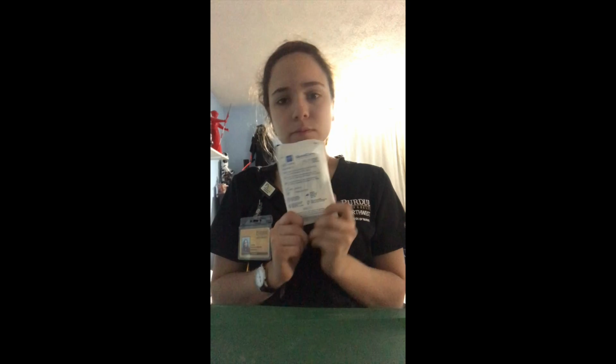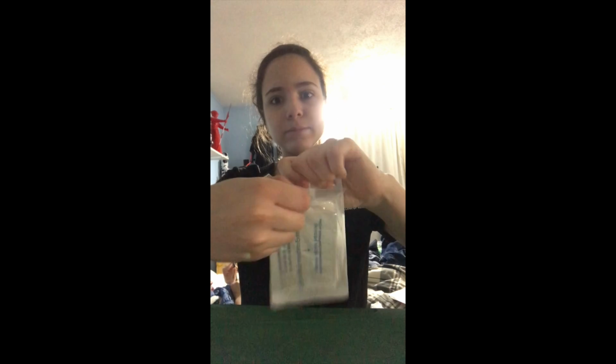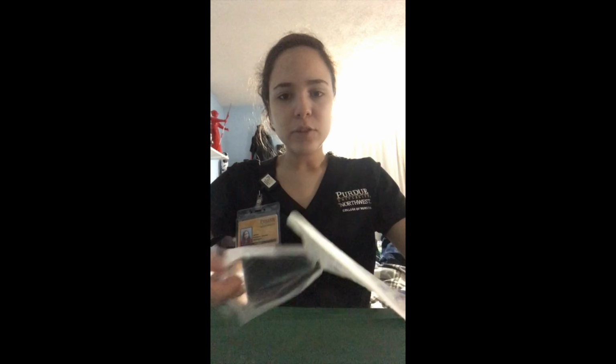So now my sterile gloves: the expiration date is okay. The package is dry and closed. So now I'm going to open my gloves. I need to open the package away from my body on my working table, and I need to drop it.